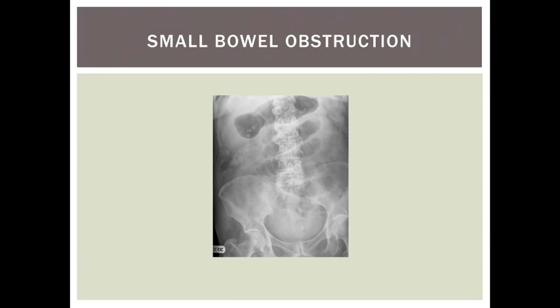Not all obstructions are as dramatic as the last example, but in this one you can see six loops of small bowel. You know this is small bowel as you can see the valvulae extending the whole way across the lumen. Again there is no air visible in the large bowel. This lady had an obstructed femoral hernia which was successfully managed surgically.